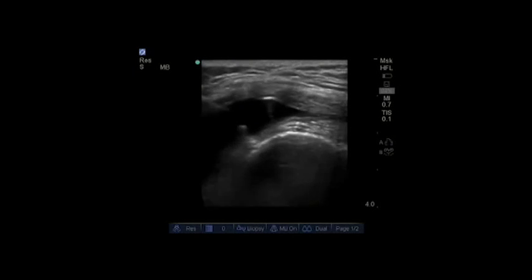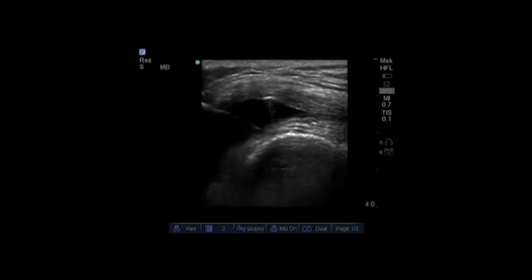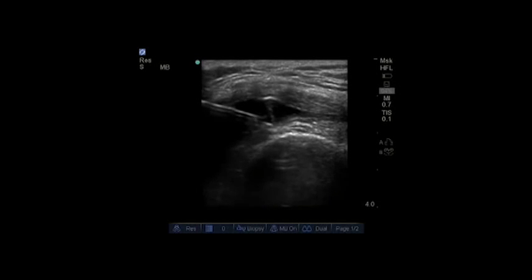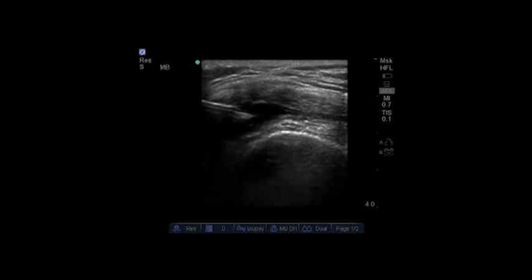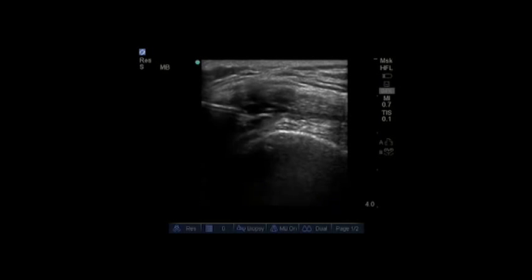In addition to injections of cortisone or lidocaine or other medications, we often aspirate the knee if there is a significant effusion of the suprapatellar recess. By doing this, we use the same approach as the described injection technique. However, initially we'll use an 18-gauge needle, insert into the suprapatellar recess, and drain the fluid out.